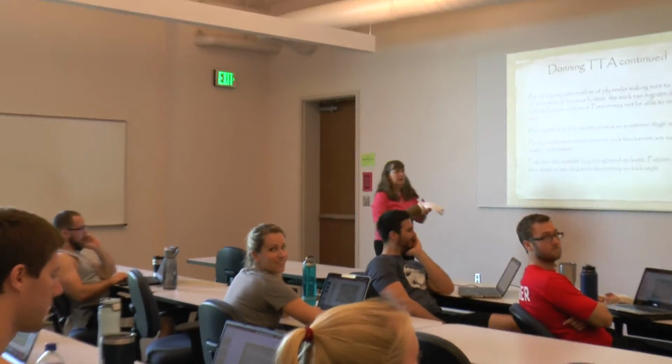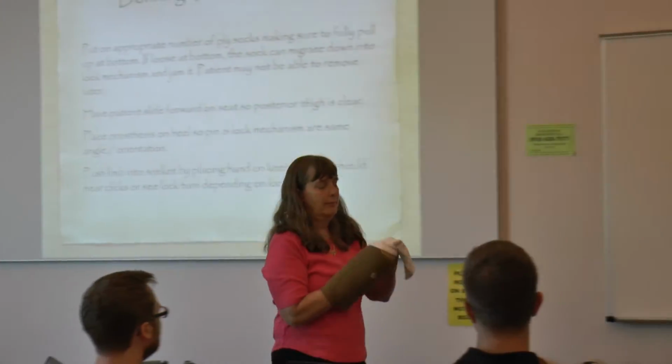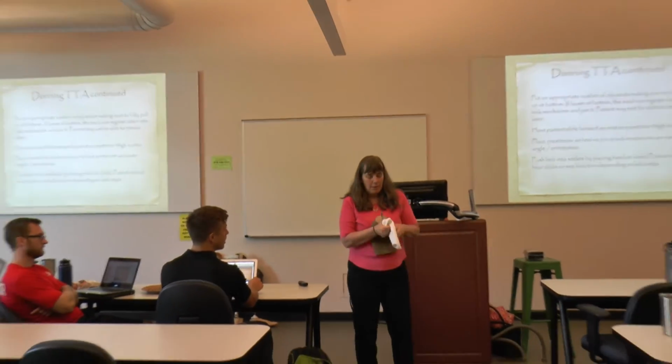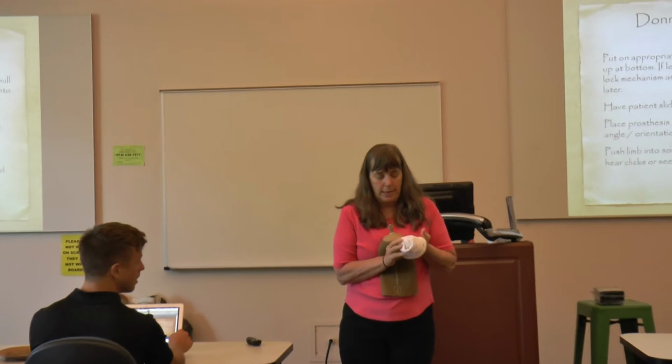Okay. If I'm putting socks on this, and obviously I'm one-handed here right now since I got this on me, so I'm going to take my hand out. The easiest thing is to gather this up.